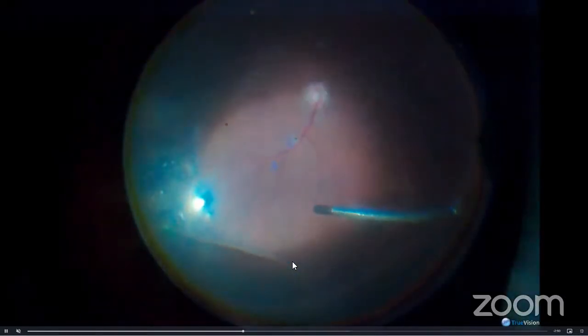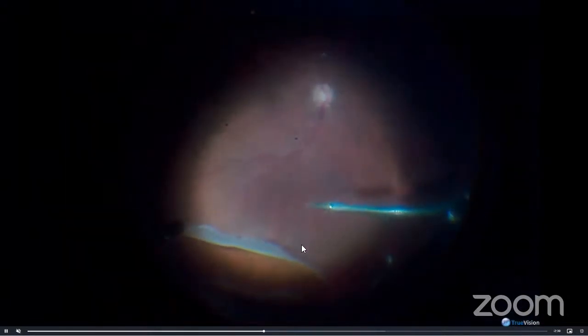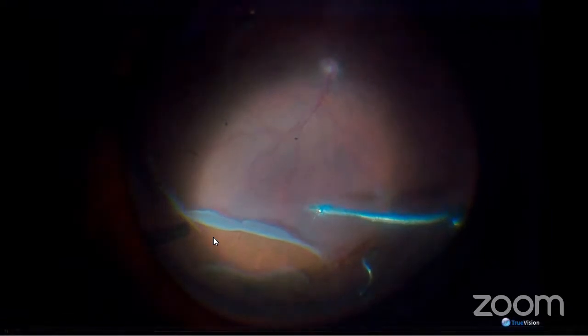To dry it up, you can rotate the eye towards the giant retinal tear. However, you can see that the edges here are staged open because there's still a collection of subretinal fluid here. You can see the gapping here.